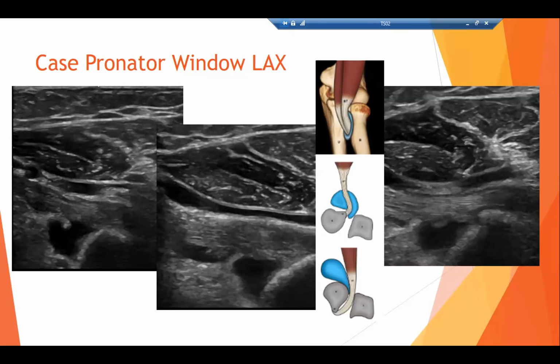Hey, Doug, could you elaborate when you say you see the impingement, what are you seeing and what clues would you have that that would be the case? Is it just osteophytes? Is it the dynamic Cobra view? How do you assess that? So for me, at least, it's a dynamic Cobra view. I don't have a number, and I don't know if a number's been validated as normal or not normal, but if I see bony hypertrophy and very little space on that Cobra view when I'm pronating and supinating, then I'm qualitatively saying that there's impingement.